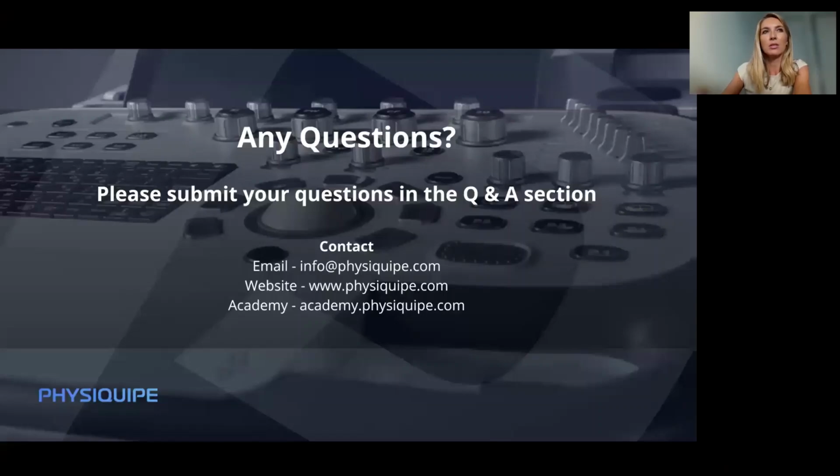Yeah. Do you use the power Doppler on most of the cases that you see, or would you just bring that function in when you've got a suspect of what's going on? Yeah, I think power Doppler can often also be false positive. So if you move your probe very quickly, you can create power Doppler. So making sure you have a really steady hand and take the pressure off the probe to pick up subtle power Doppler is really helpful. Again, the handheld devices and the lesser quality machines aren't as sensitive in picking up power Doppler. So I would use it with caution depending on the machine you use and depending on the clinical history. Yeah, okay, great, thank you.